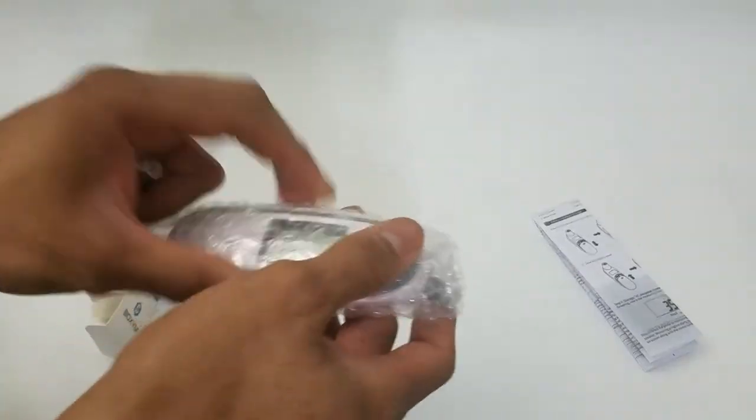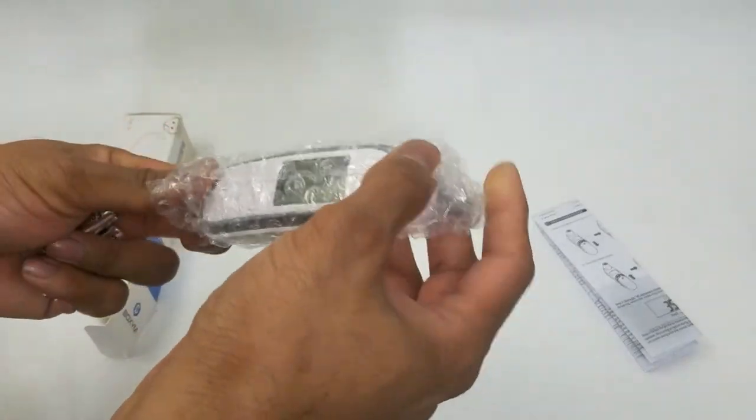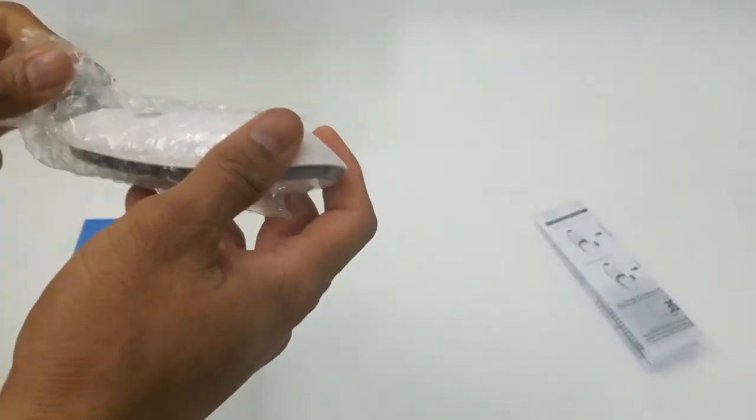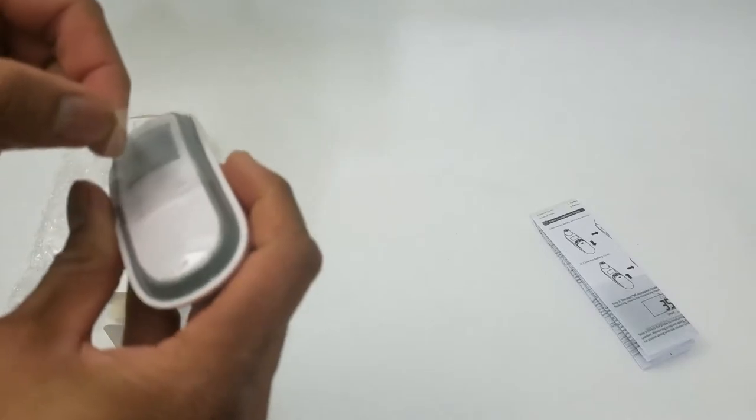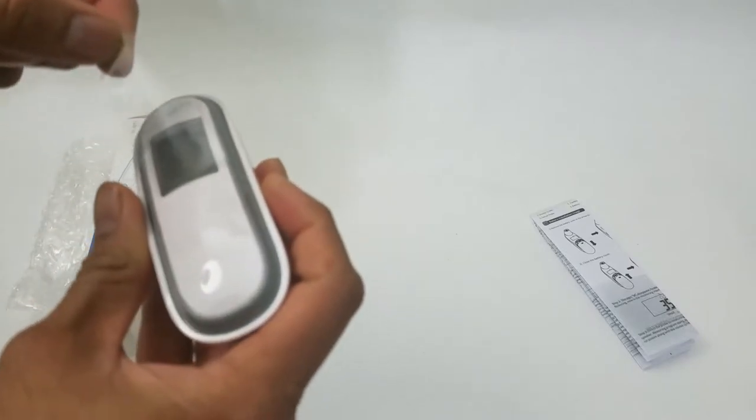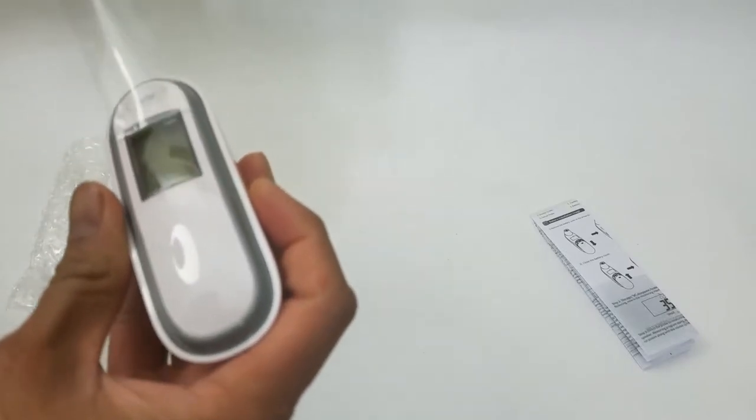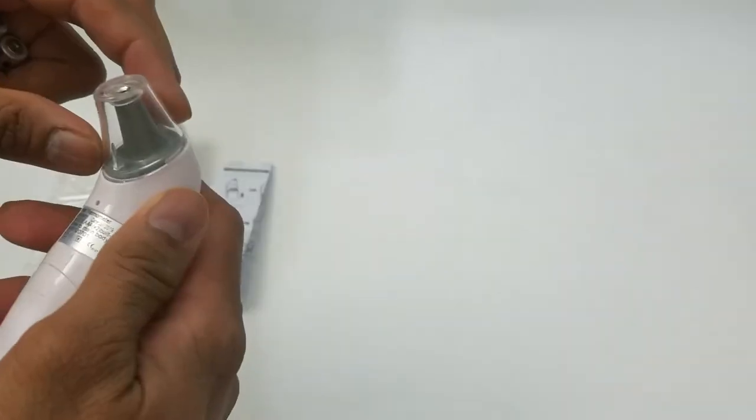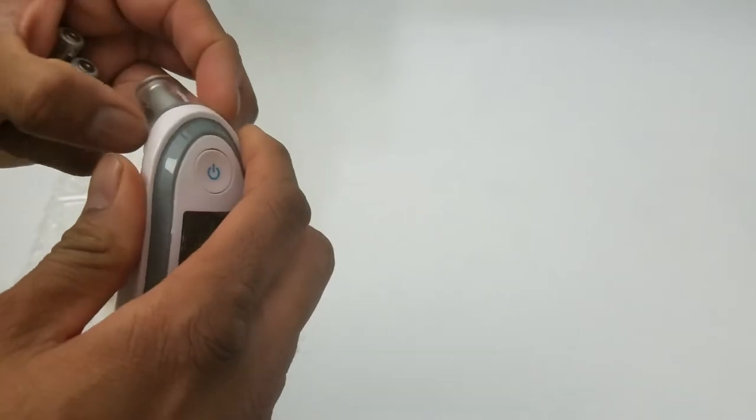Now for the unwrapping experience. There's a clear plastic seal on top of it. Let's open it up.